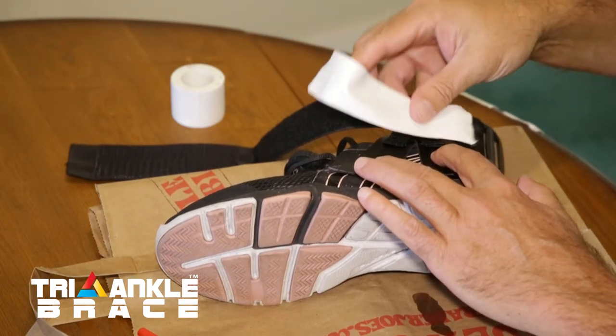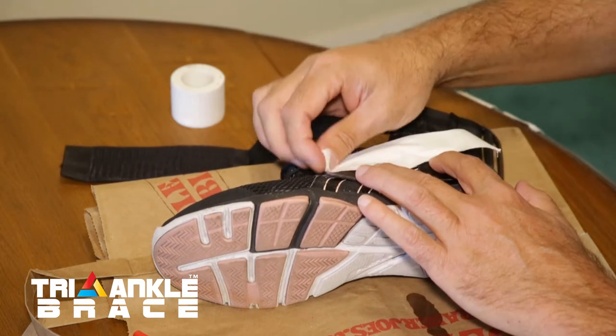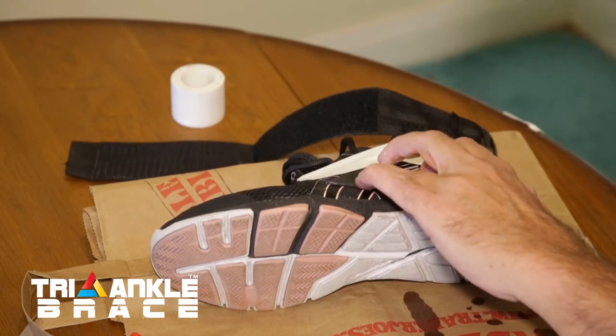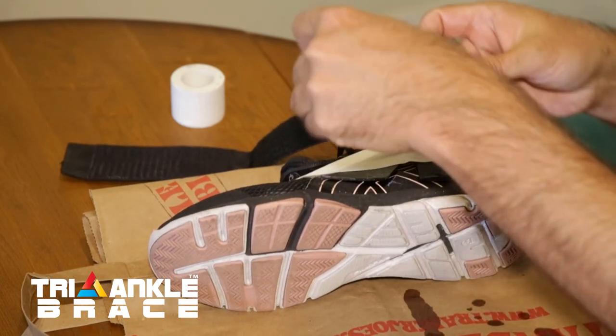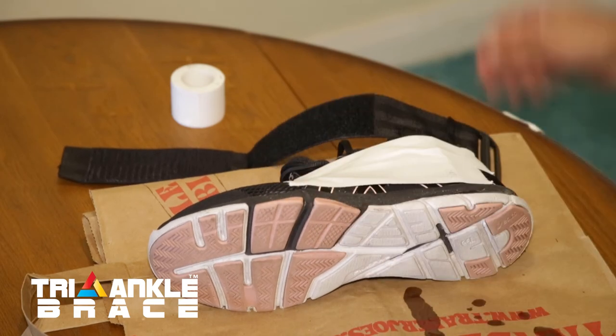Now you can use some athletic tape to tape it in place while it dries. Since you're not going to need it for your ankles anymore, it'll work great for this. Make sure you don't get it on your fingers. You let that sit for 24 hours and dry, and you're ready to go.